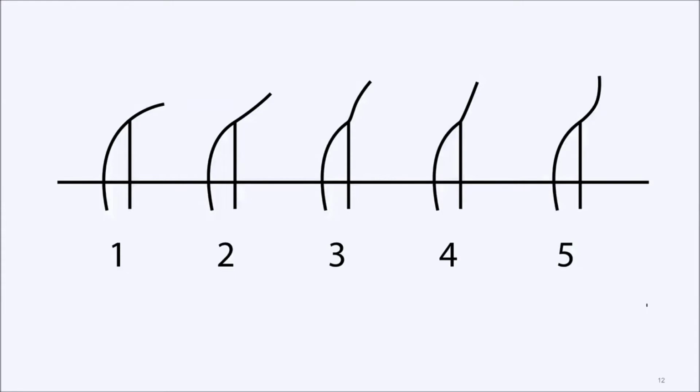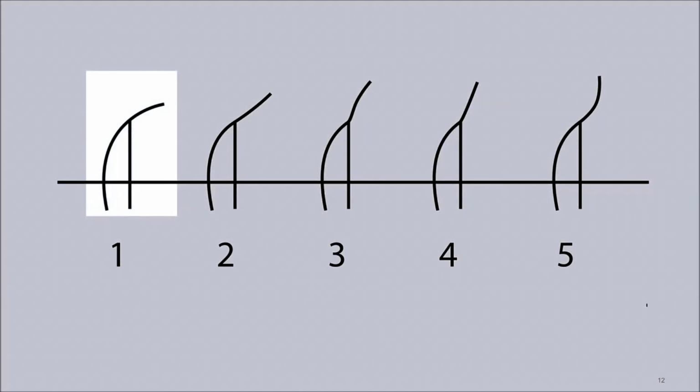Sandra Bokern's group looked at scleral shape in relationship to how scleral lenses were fitting on the cornea. And they classified the sclera into 5 different shapes. As you can see in the graphic on the left, shape number 1 has a fairly steep fit. This shape would allow the scleral lens to fit further back onto the sclera versus shape number 5, which has a flattened type of shape as you go from the cornea to the sclera.